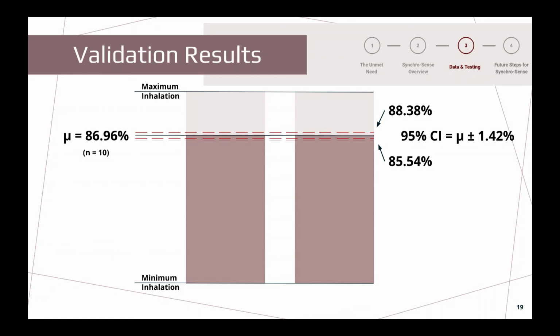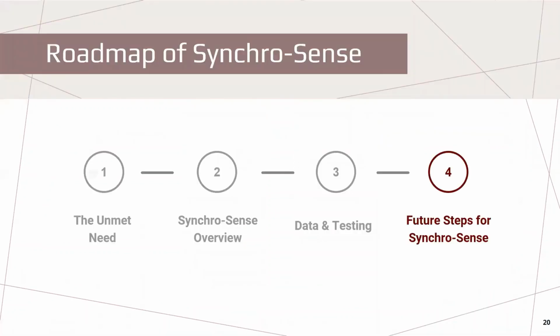We can further improve these numbers in the future by raising the threshold tension value from the sensor in our algorithm, causing our device to wait for tension values that are even closer to the maximum before image capture. Thank you, Justin.